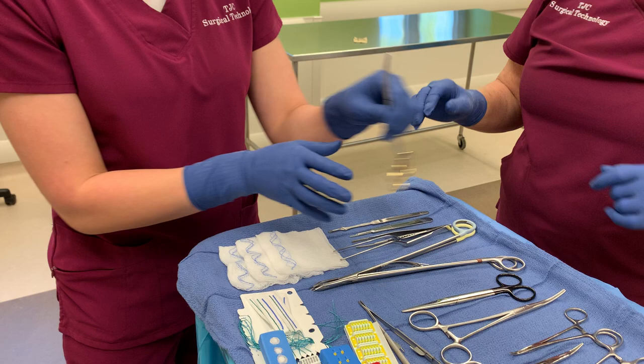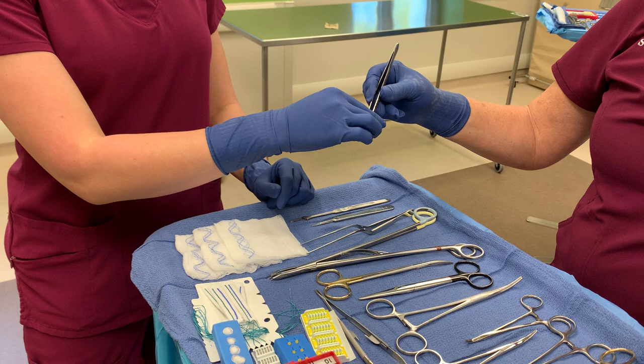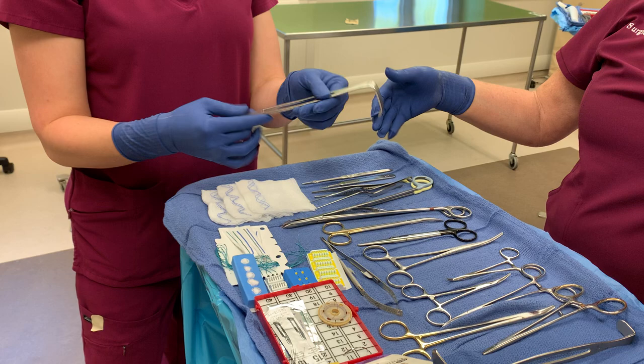Now for forceps, we're just going to do DeBakeys. If I'm passing forceps, I always grab it by the tip, pick it up here, and just place it in their hand just like a pencil. That's how they're going to take their forceps.